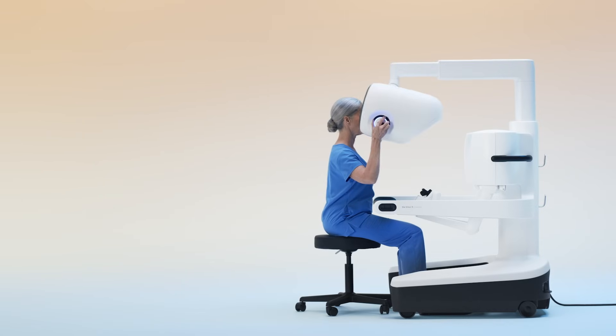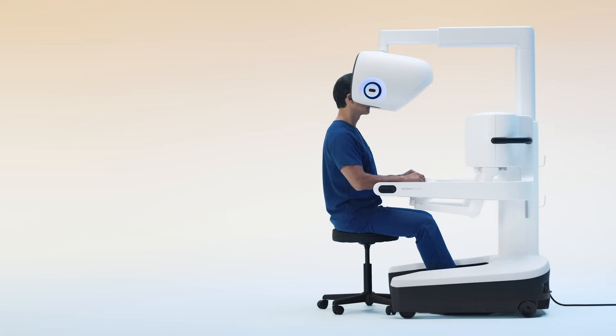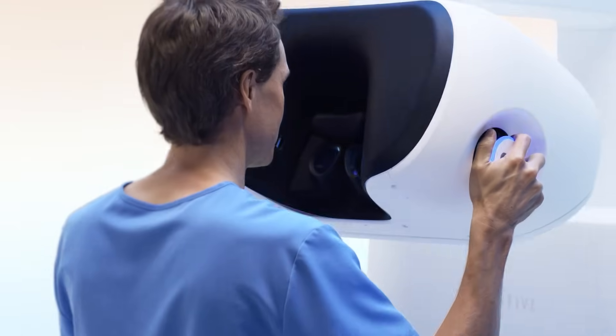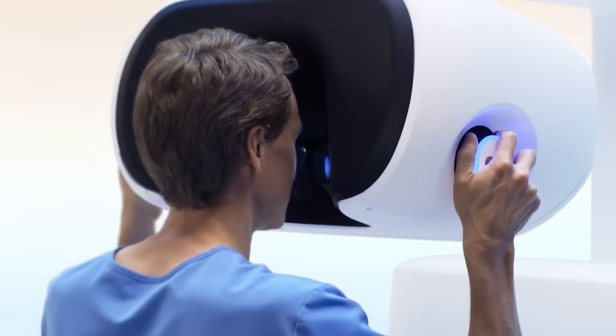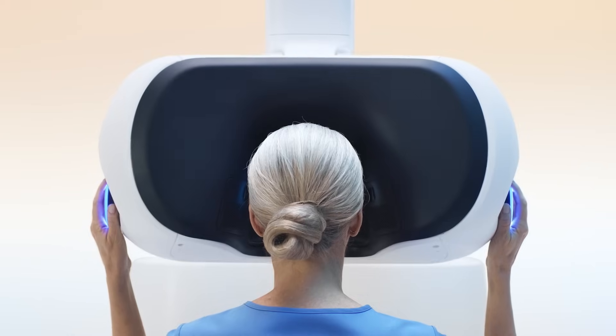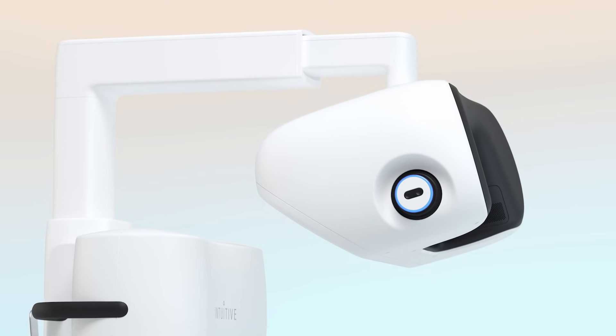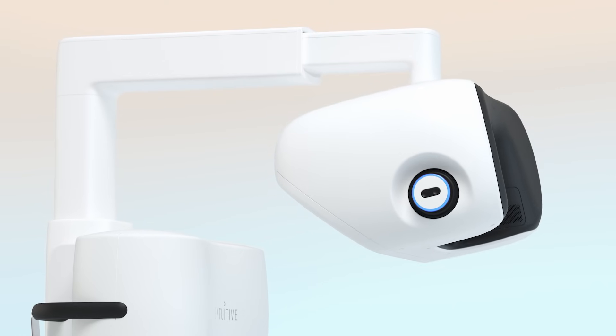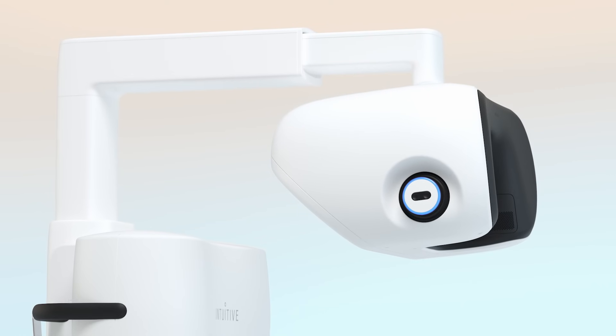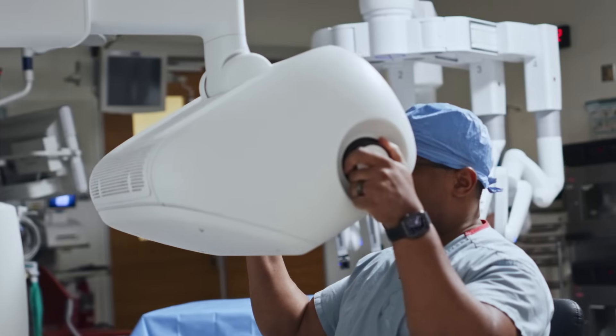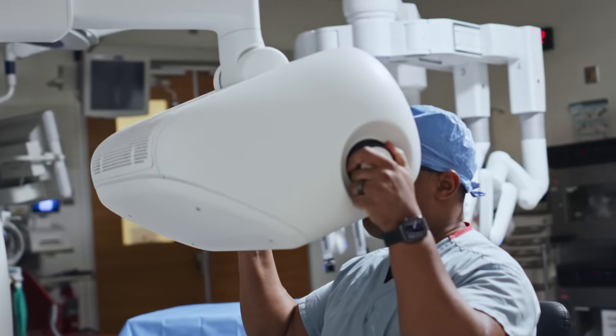The ergonomics, the ability for me to move the headset where my head goes in and move it exactly where I want it to be in a variety of different positions. I think that really is going to help elongate my career and make surgery more comfortable.